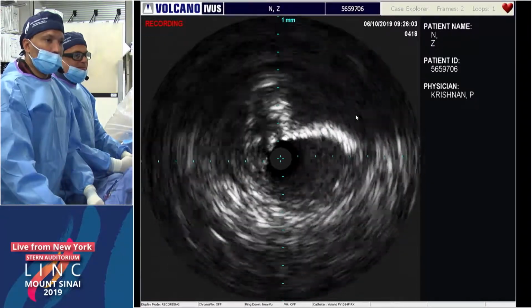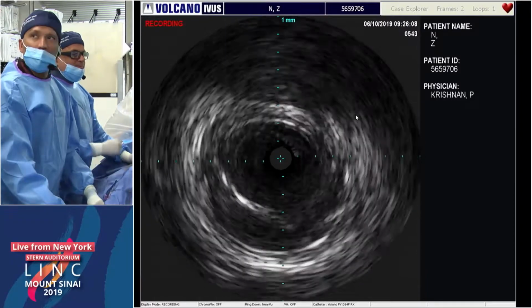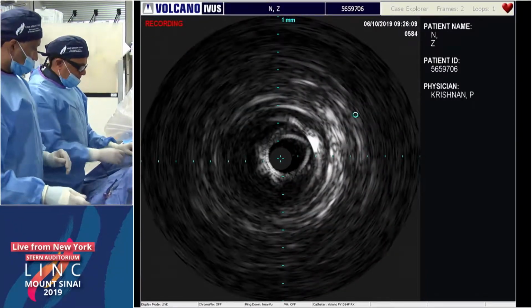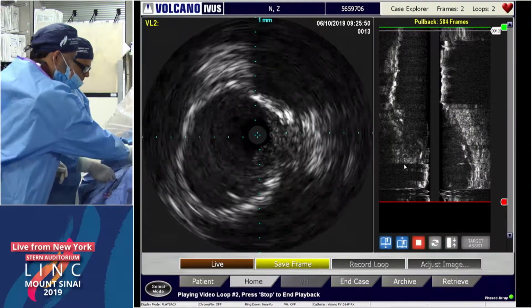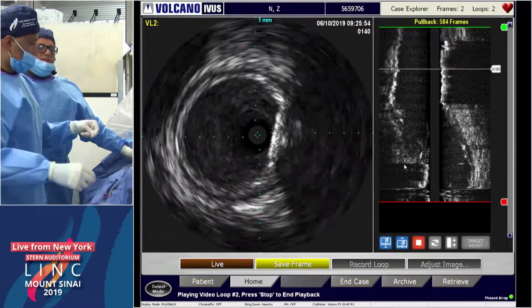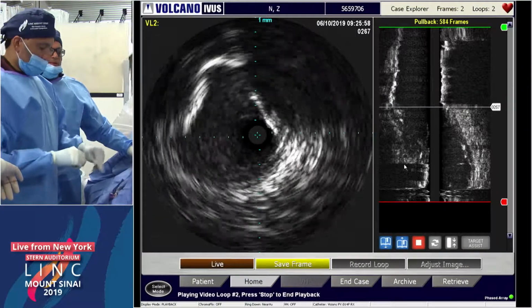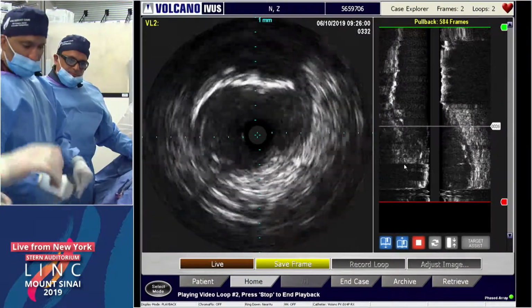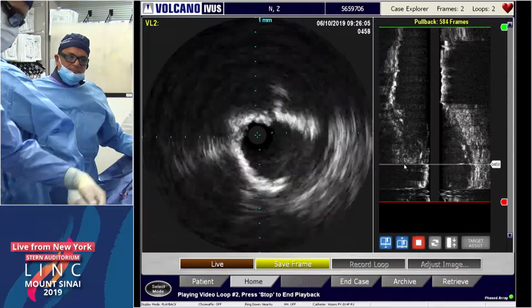Dirk, I'll take the pushback side as well. I think all the things you're bringing up, Dirk, you're thinking acutely now. You're thinking of the short term, but we don't know the long-term results of Supera or any other stent in the common femoral. And again, to highlight the surgical literature, it's 5 to 7 year literature, where everything endovascular is shorter than that. I actually think Superas do very well in the common femoral if appropriately sized. So I wouldn't necessarily hesitate to use it if I was going to use a scaffold.